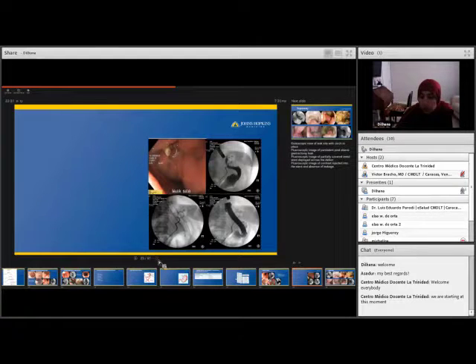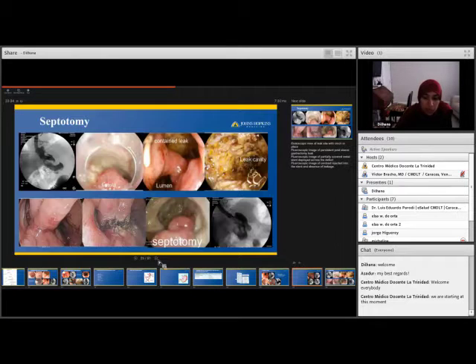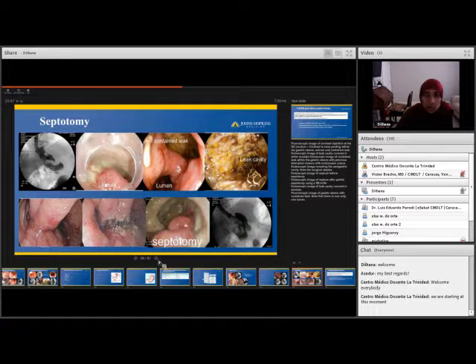So you're draining externally, so there's percutaneous drainage. The stent is not only opening up, if there is a stricture, it's opening up that stricture, but it's also allowing you to feed the patient enterally. And sometimes you have to put in an NJ tube if the patient can't tolerate, but at least the patient doesn't have to stay in the hospital for TPN.